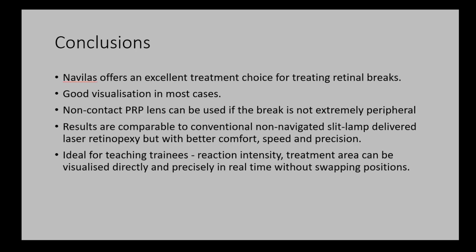In conclusion, Navilas, in our experience, offers an excellent treatment choice for treating retinal breaks with good visualization in most cases. A non-contact PRP lens can safely be used if the break is not extremely peripheral. The results are comparable to any conventional non-navigated slit lamp delivered laser retinopexy, but with better comfort, speed, and precision. It is also ideal for teaching trainees as reaction intensity and treatment area can be visualized directly and precisely in real time without having to swap positions at the slit lamp. Thank you for your attention.